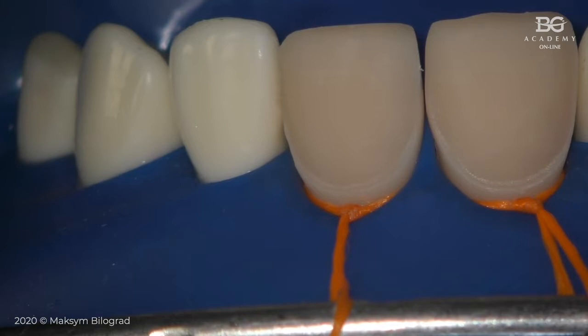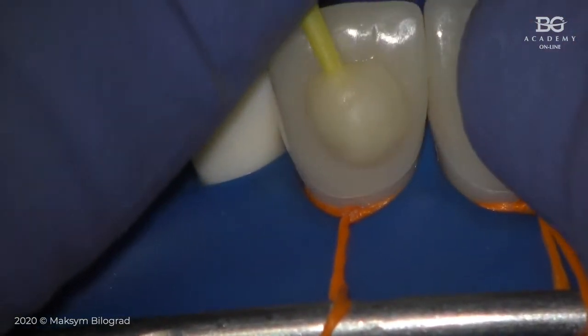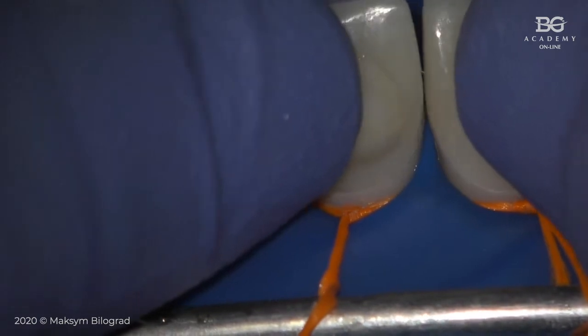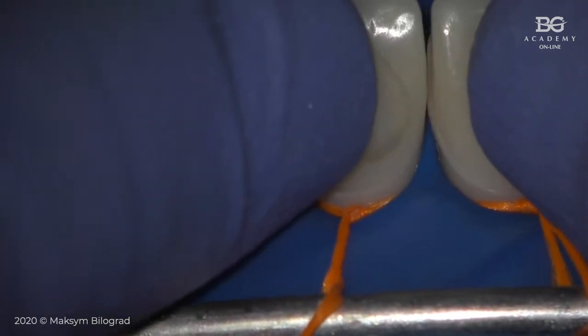Okay, and another thing, I would like to see if I can, for example, bond 2 central incisors at the same time. In my case, if you remember, I didn't make an adjustment, so let's pretend I will have the same problem in a clinical case.